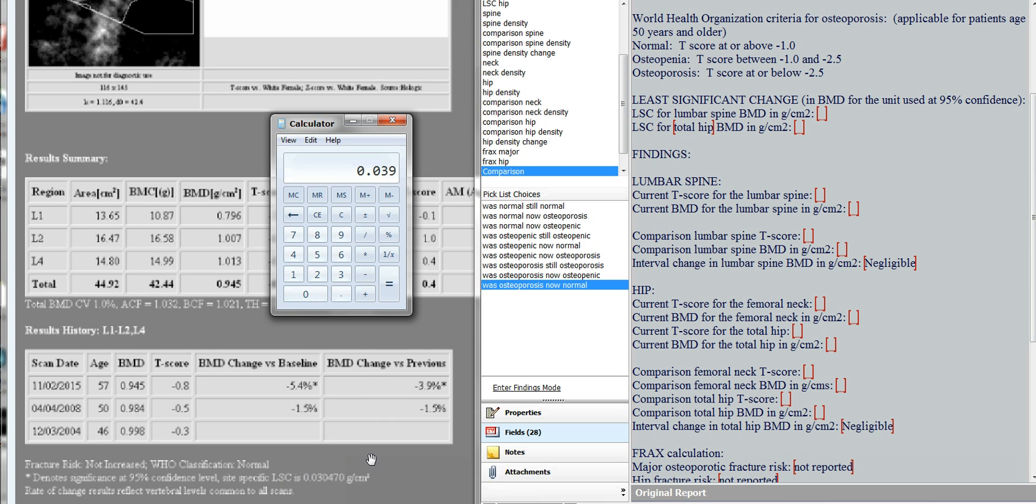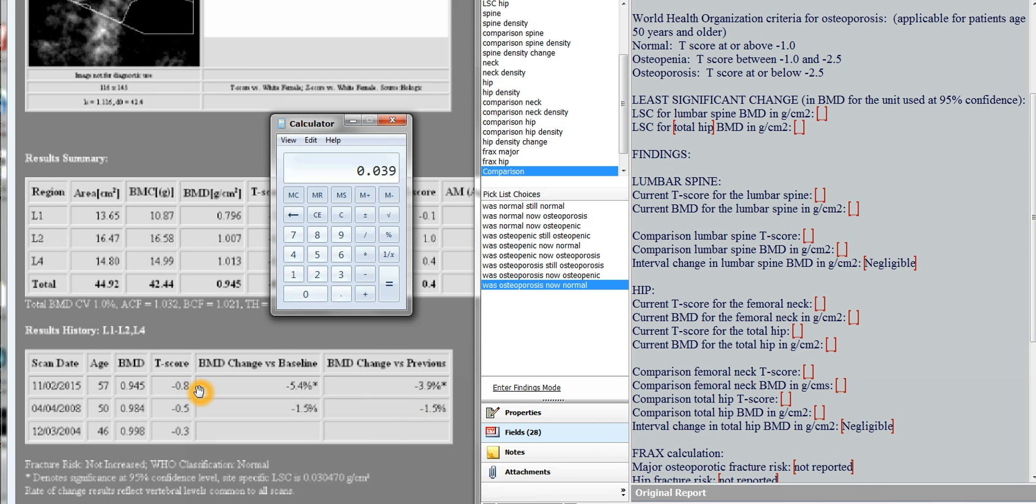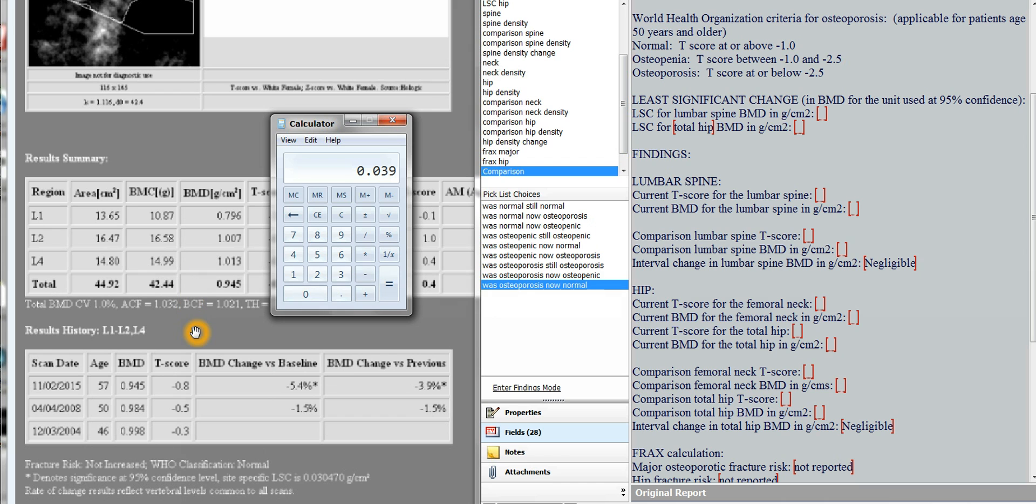So it is a statistically significant change. Over these seven years, the bone mineral density in the lumbar spine measurement has dropped by 3.9%, and it is statistically significant. It seems to me like more likely what's happened is while the bone mineral density was dropping a little bit, a lot of the bone mineral density was being artifactually elevated by degenerative sclerosis being deposited, but that is a clinical judgment based on the picture. So the statistical analysis shows that there has been a statistically significant change.